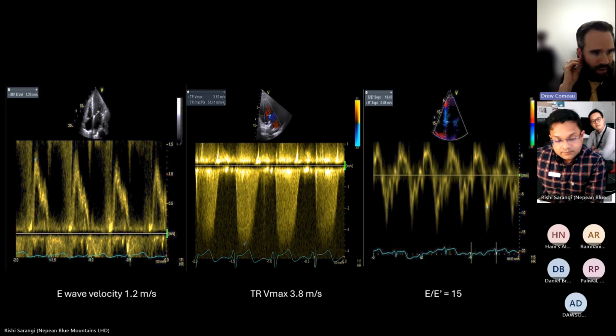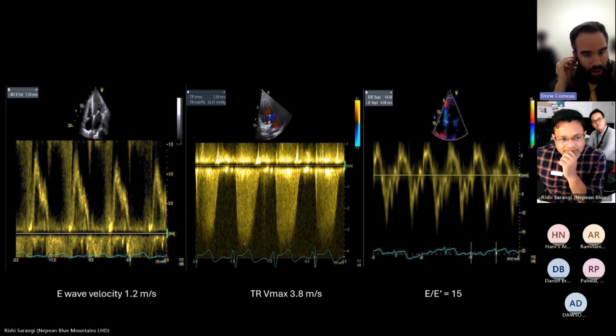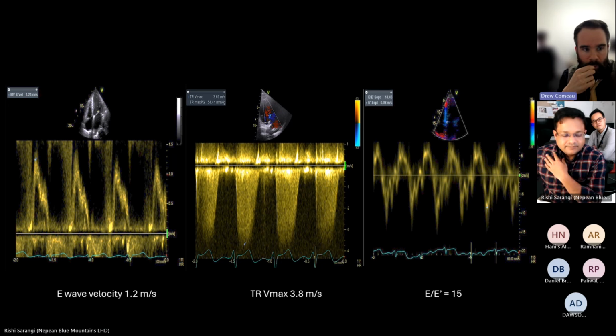Given the tachycardia, the E and the A are fused. I think you're probably calculating the left atrial pressures. So in the setting of severe MR and reduced LV function, you could use the E/E prime. I think in preserved LV function, we can't. But taking that into consideration, the septal E is normal and the E/E' septal is within that gray zone.